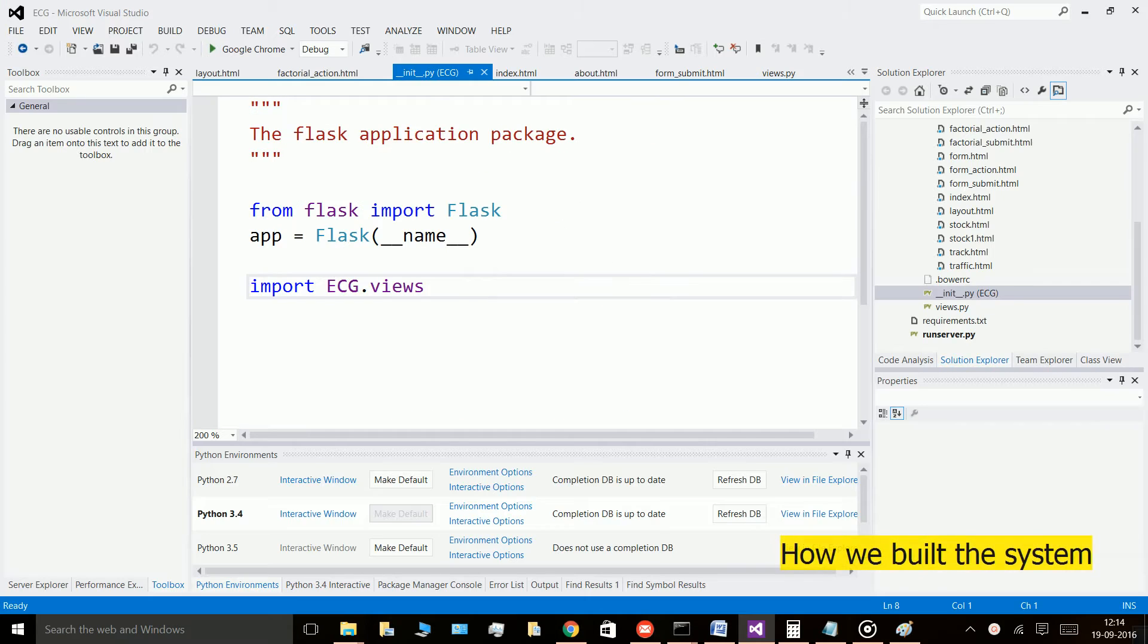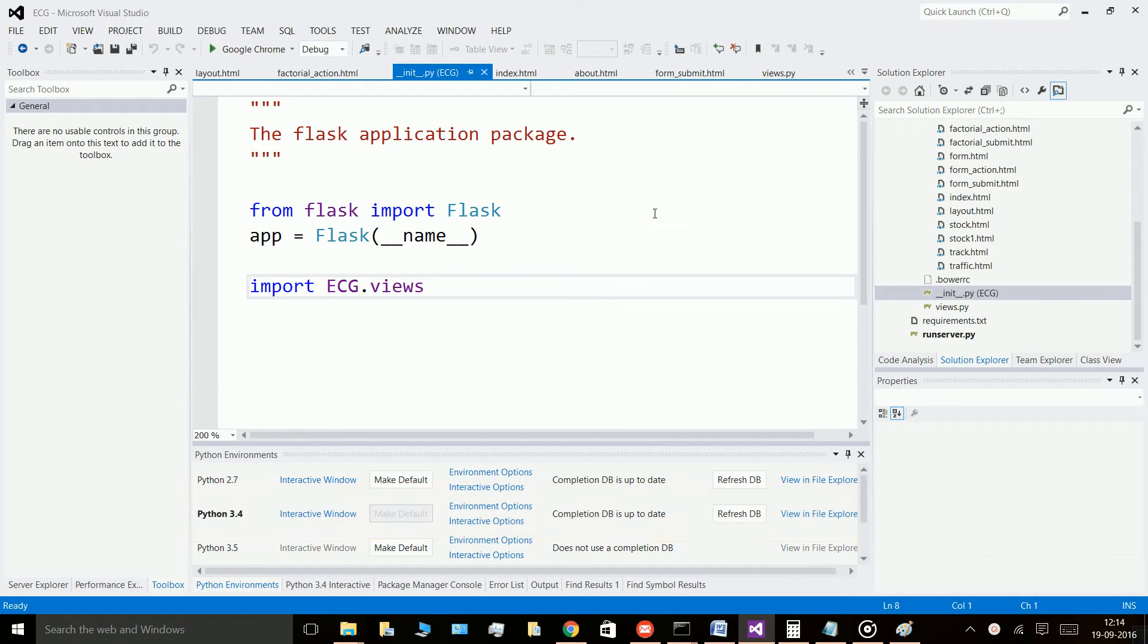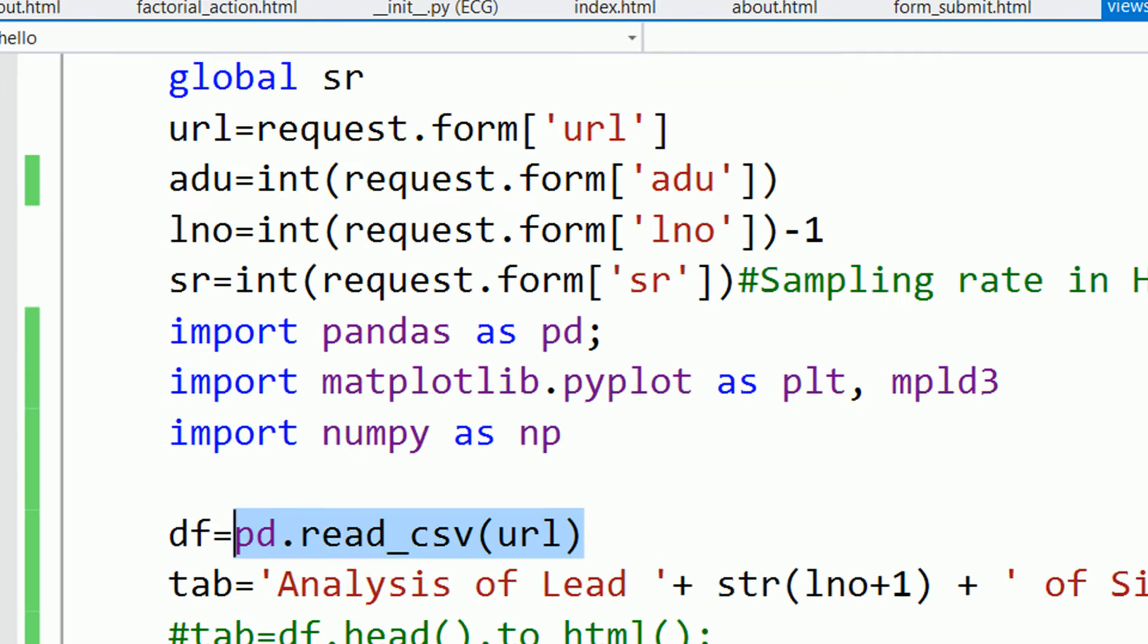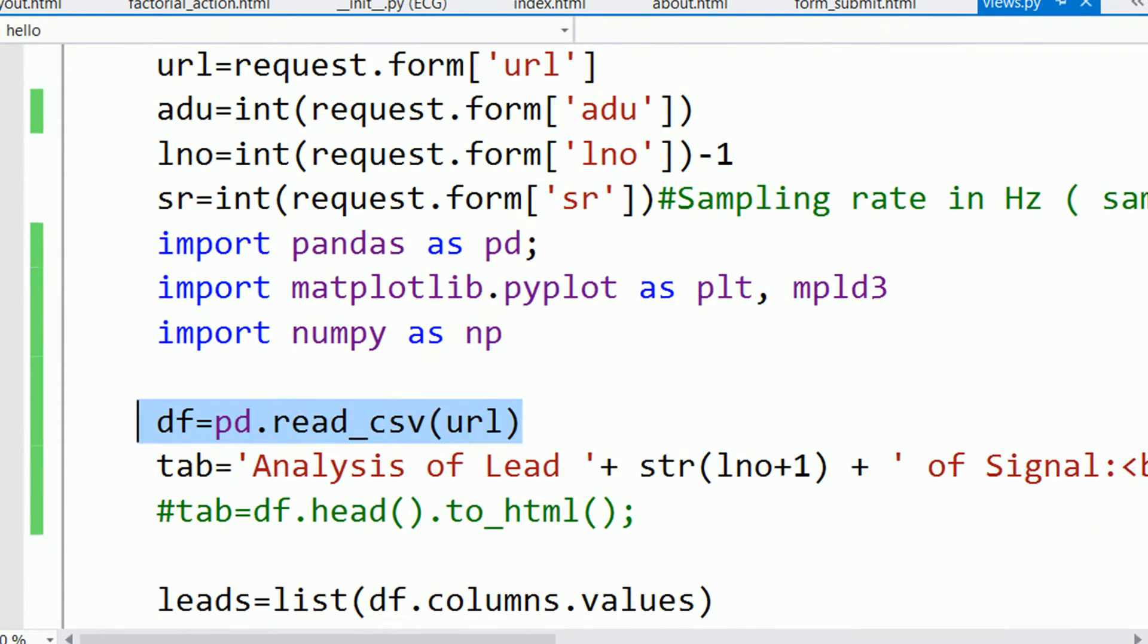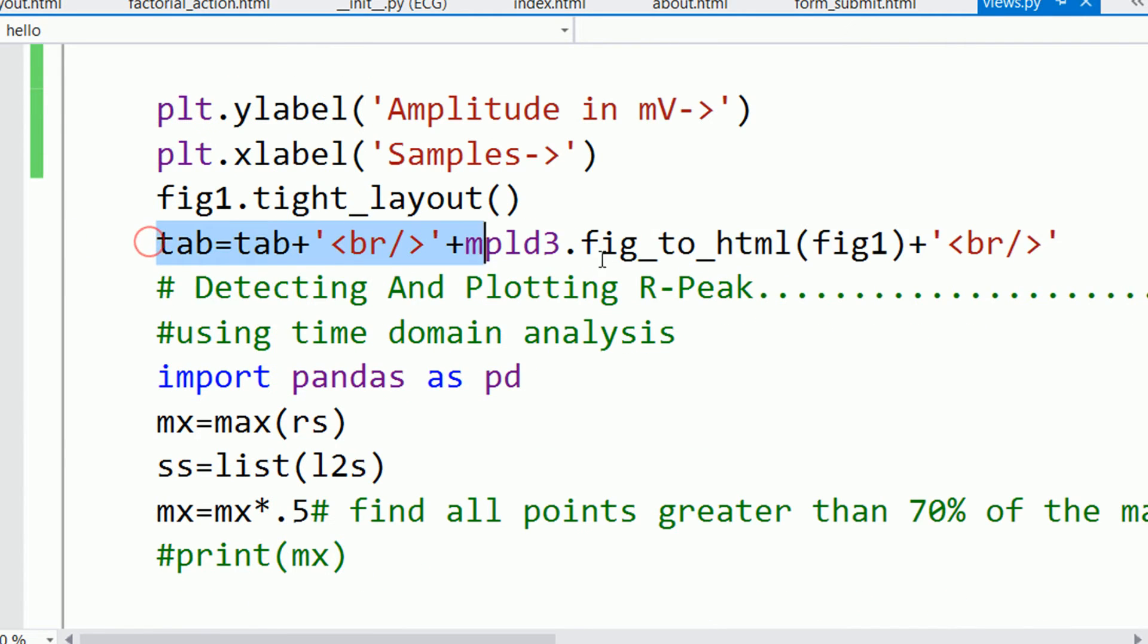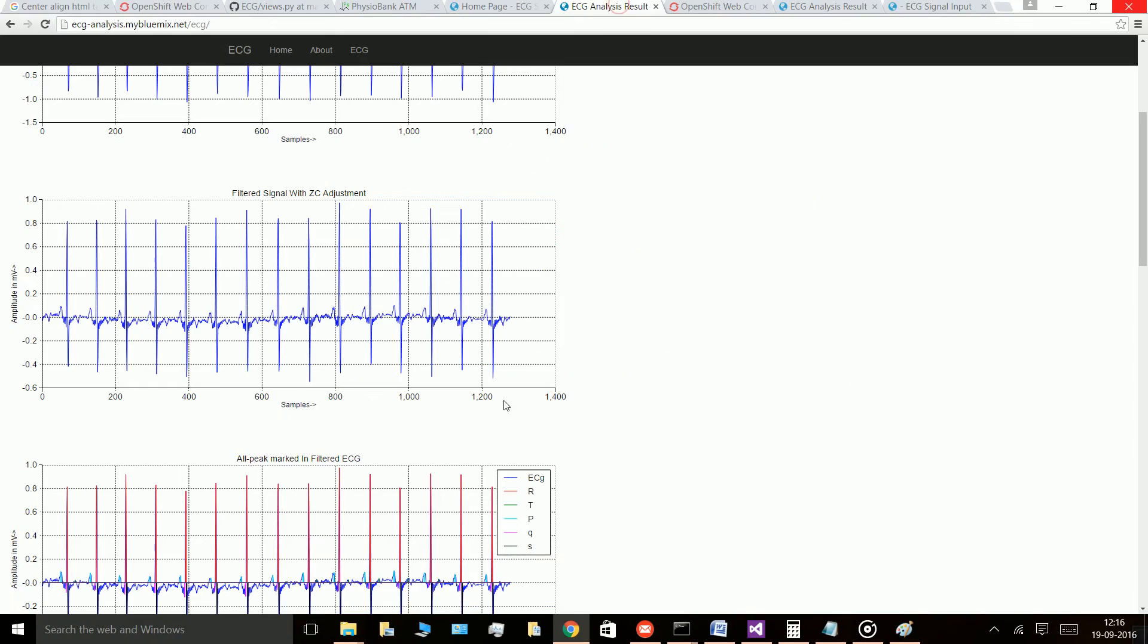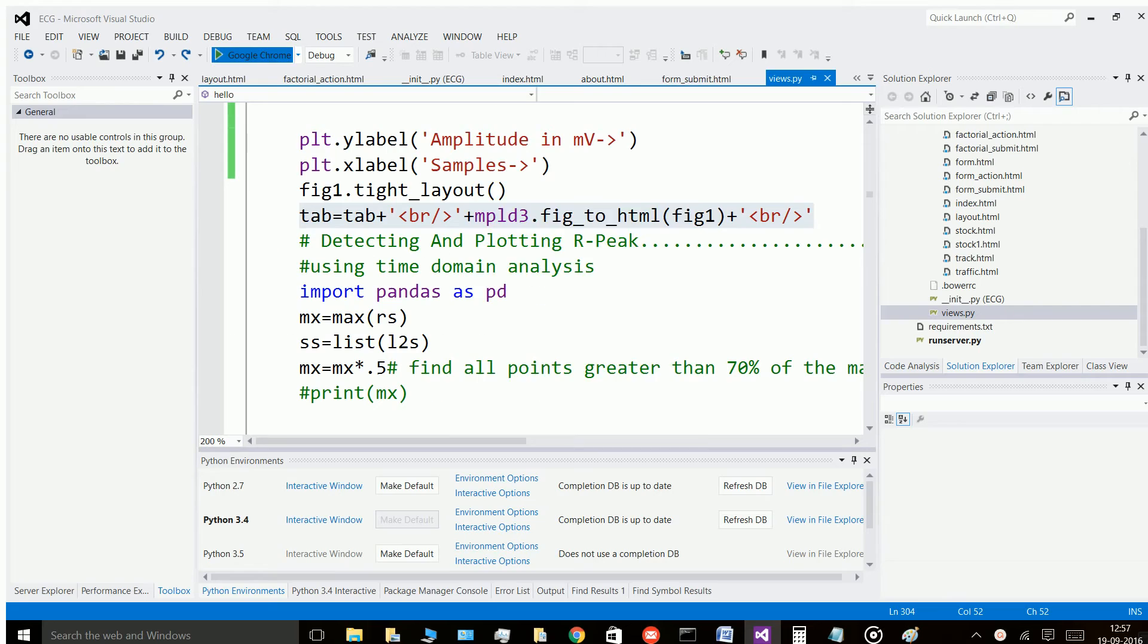We essentially built our system in Python 3.4 on Flask framework in Visual Studio.net. We use Pandas data frame to read and format remote CSV files, Numpy for processing the signals. Visualization is created using matplotlib which is then rendered on the web page using MPLD3, which is an interface for Python and d3.js charts.